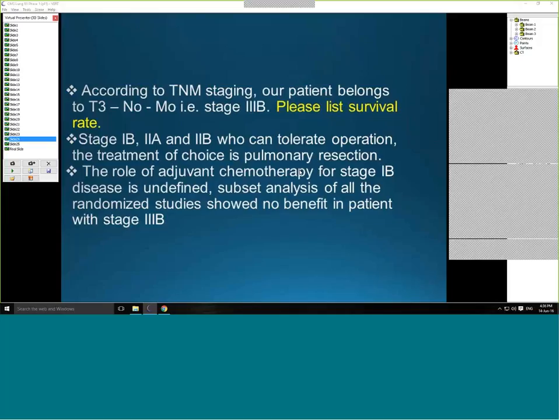Students then move on to the Varian Eclipse system and to set up the treatment planning, again, doing the contours of all of the organs and organs at risk. They will set up the field beam shapes. They will put in their doses. They will create a DRR as well as a dose volume histogram.